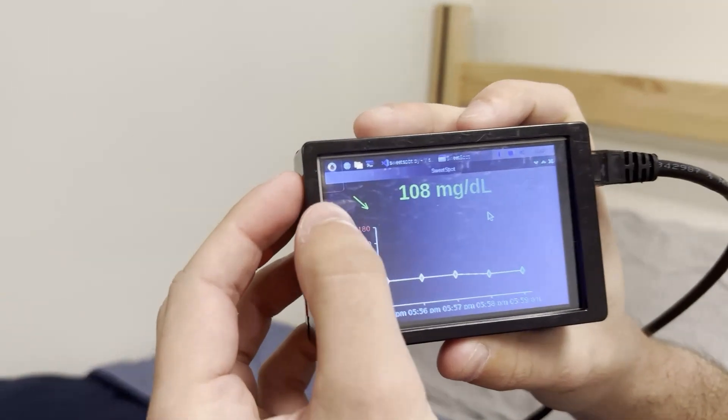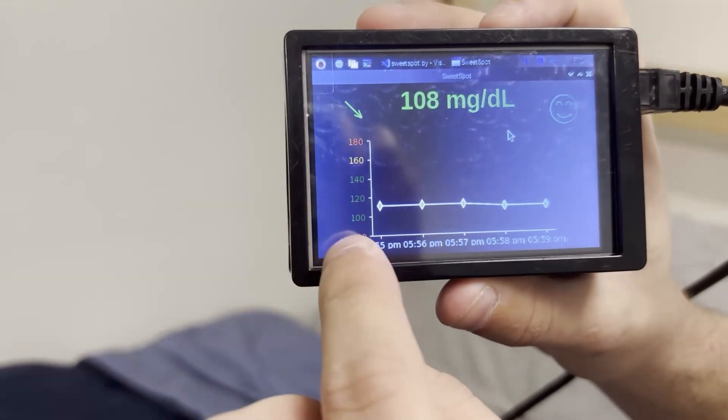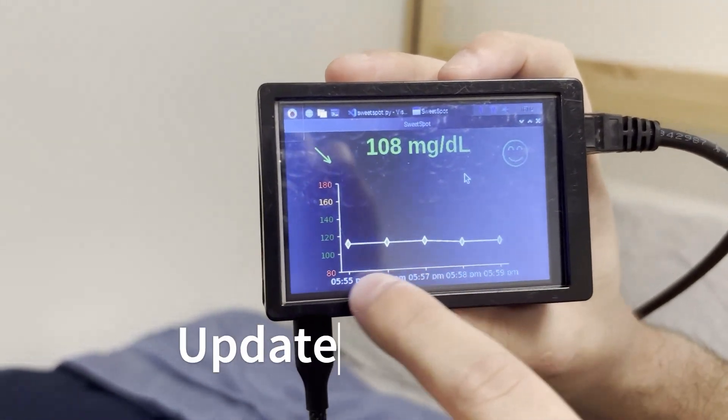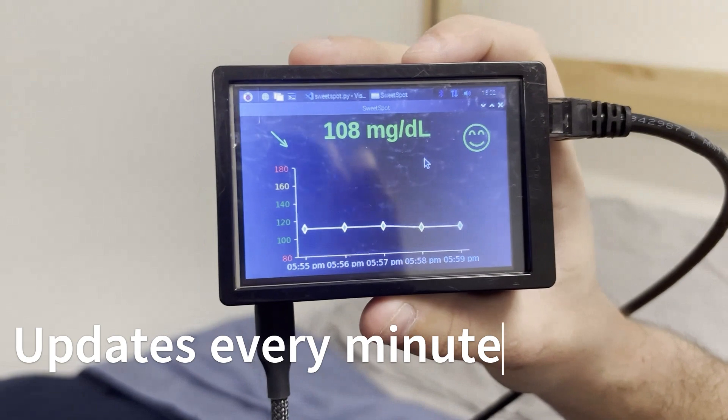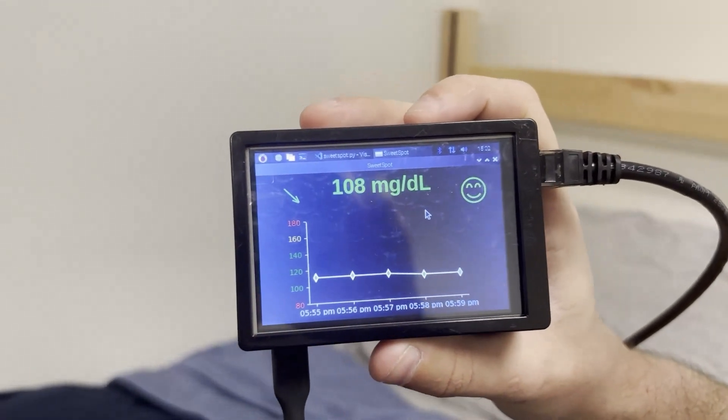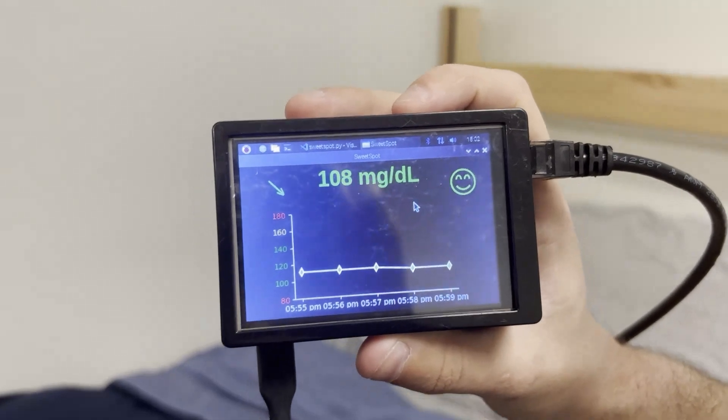Right here is the trend arrow and then this whole graph is the trend graph — it stores the last five most recent blood sugars. It gives you the time and the value, and color coordinates whether you were in range, out of range, or slightly out of range.